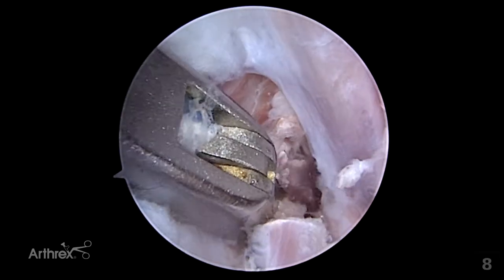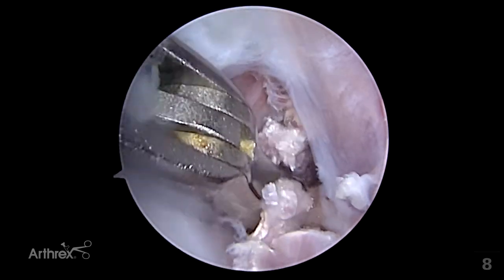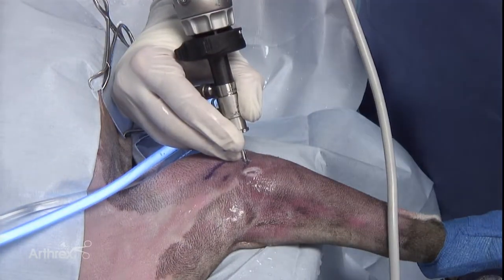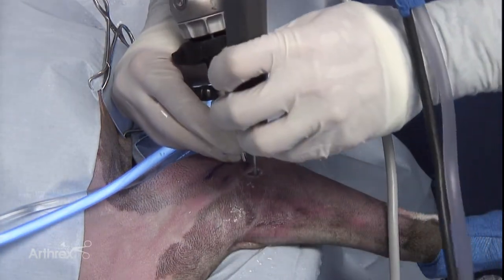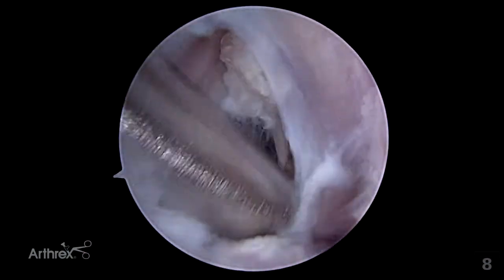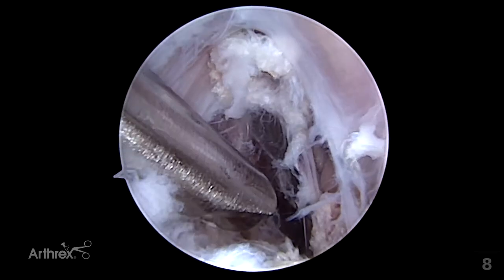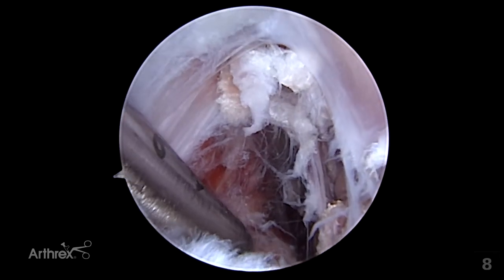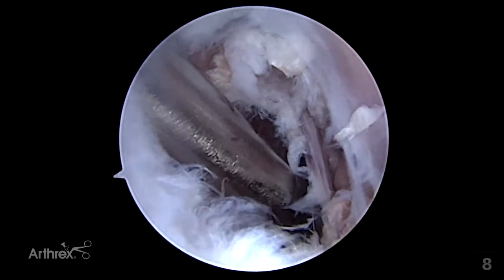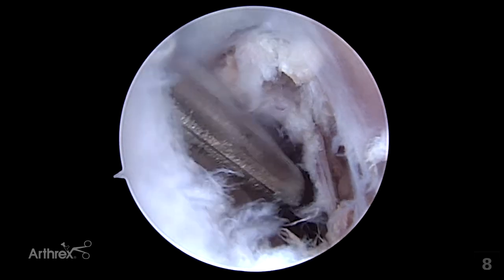At a certain point in this process, vision may be obscured both by the resected portions and collapse. It is beneficial at this stage to remove the punch, place the shaver back into the joint, and suction and shave this area to expose more of the tendon. At this point it is possible to see the tendon ends have been sectioned and the neurovascular bundle sitting directly adjacent to the shaver tip is exposed.